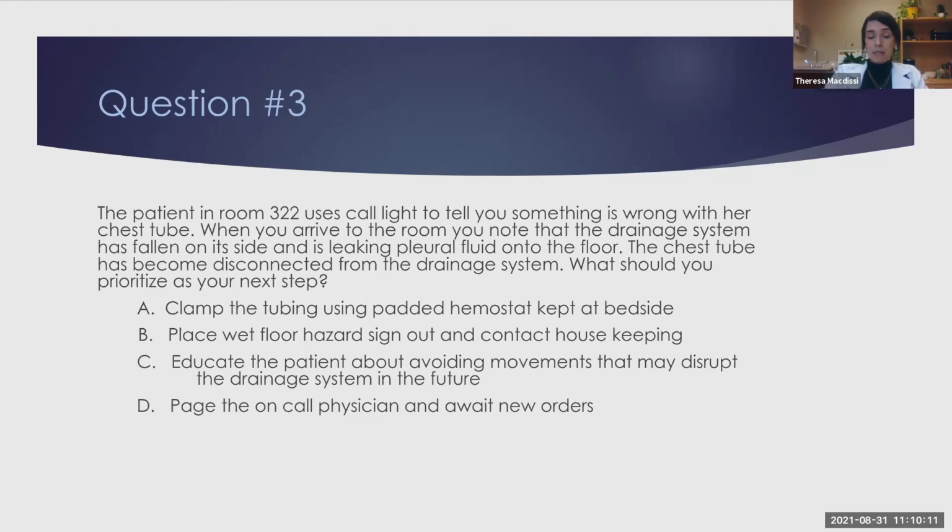This is something that is time sensitive. So, air could build up in someone's interpleural space rather quickly. So you may not want to wait around 5, 10, 20 minutes until your provider calls you back. So that is something you're going to tell them that happened, but first order of business would be to clamp the chest tube and prevent a tension pneumo from occurring.